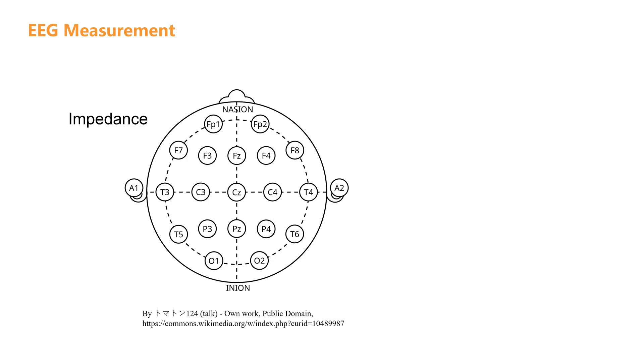During measurements, the software will display whether the impedance meets the requirements. If the electrode shows a green icon, it indicates that the electrode meets the requirements. If the software displays red, it means that further reduction of the impedance is necessary.